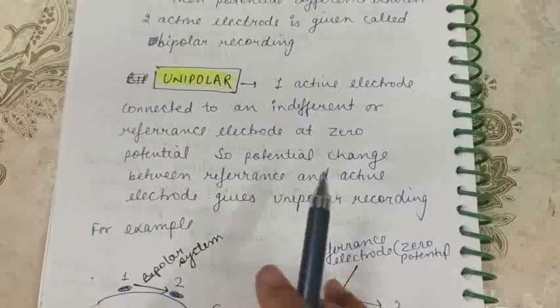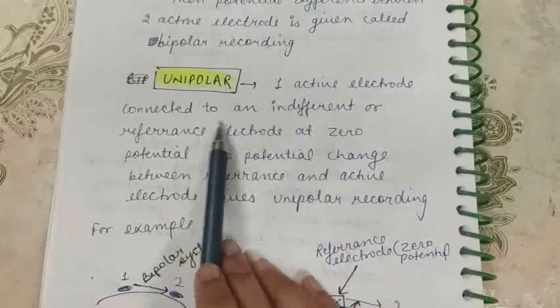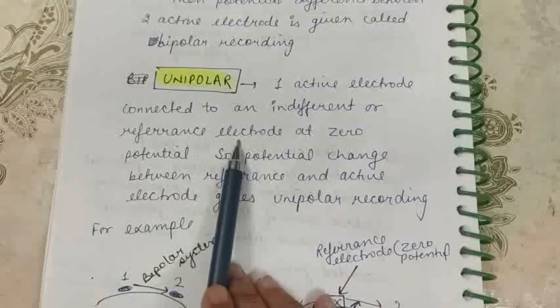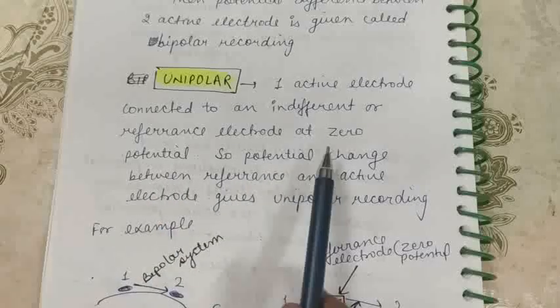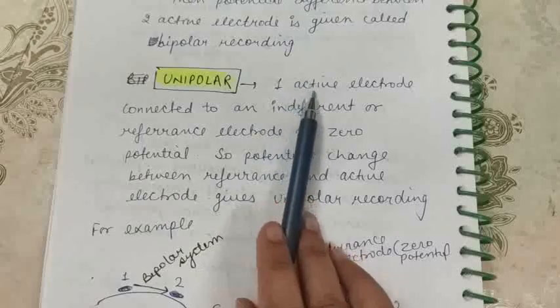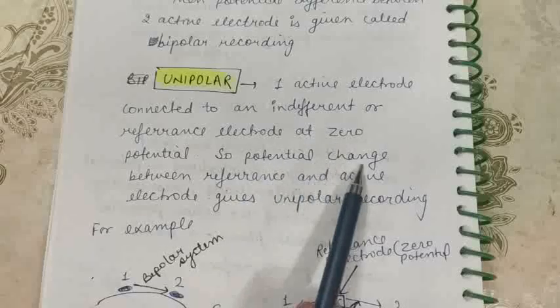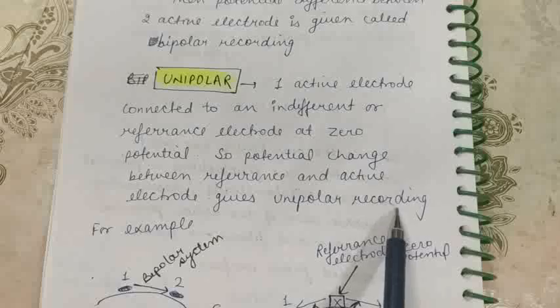In unipolar, we have only one active electrode, which is connected to some indifferent or reference electrode at zero potential. Fine. It is not considered positive or negative, but we are just recording the potential change from this active electrode to some reference point, which is the reference electrode. So the potential change between the reference and active electrode gives the unipolar recording.